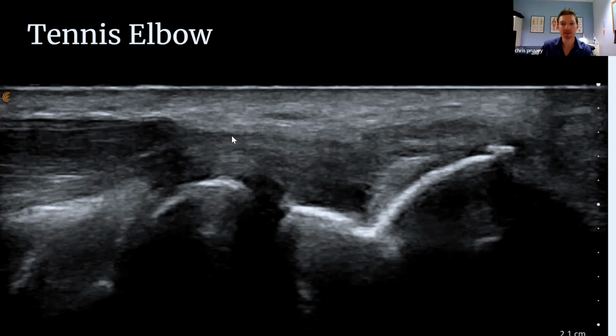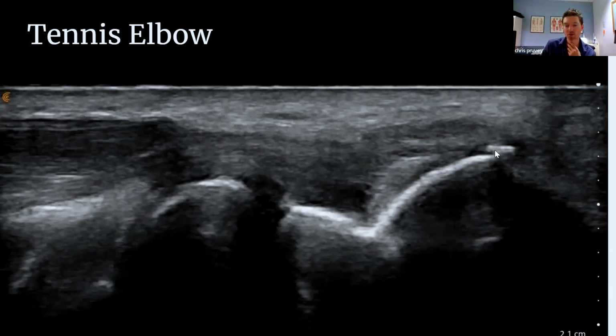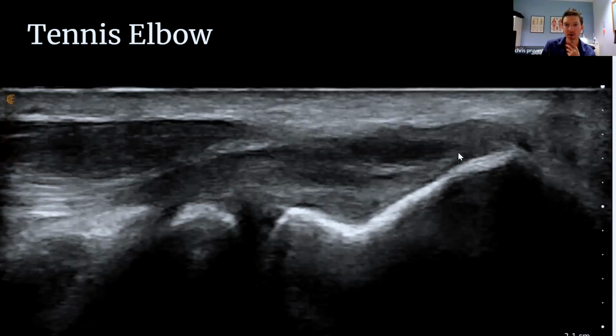And this patient in particular had a really, really sore area, normally right at the end of this bone, at the proximal attachment here. You see this tiny little defect in the bone here. It was really, really painful, struggling with work, all the rest of it. You can see it again here. The tendon is a little bit darker here. So he's got a tendinopathy. The fibers in the tendon are a bit inflamed, and he's got this bony insertional defect, something we see all the time. If you scanned my tendons, some of them may look like it, but they can be really, really painful and limiting.